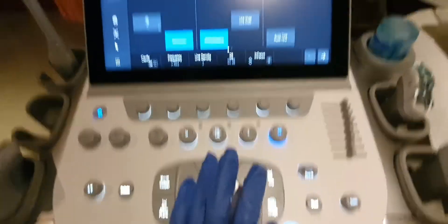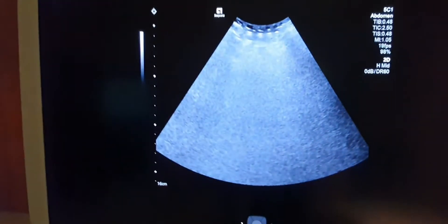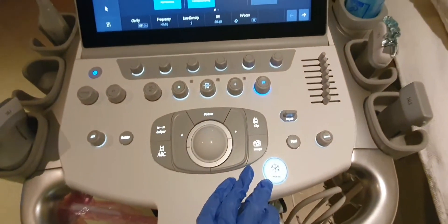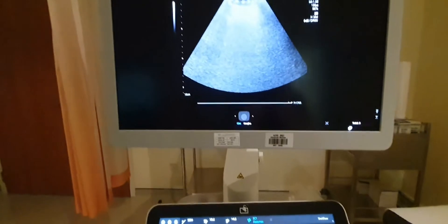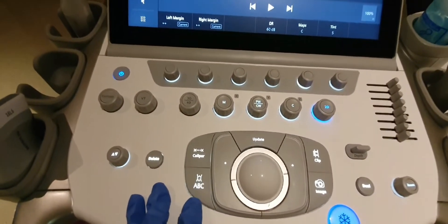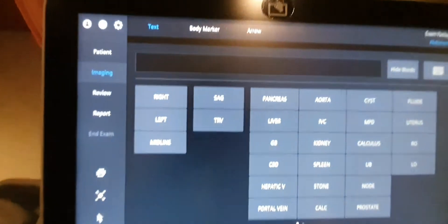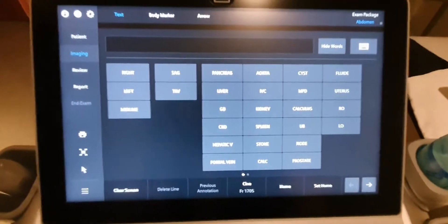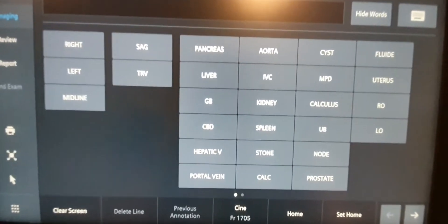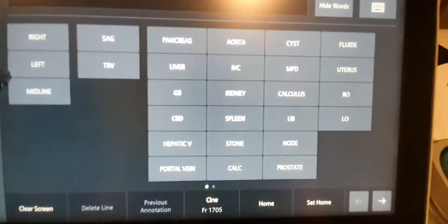Once you've scanned the anatomical structure, you need to press freeze — the image will automatically freeze. Then you add an annotation by clicking the ABC button. A list of all anatomical structure names appears: right, left, sagittal, transverse — everything is in here.